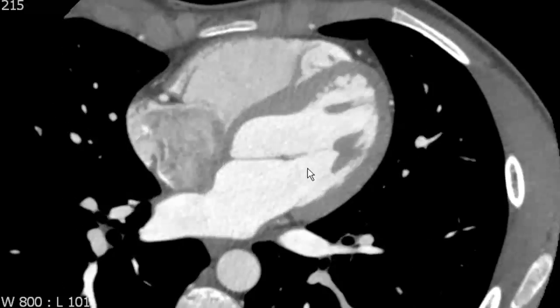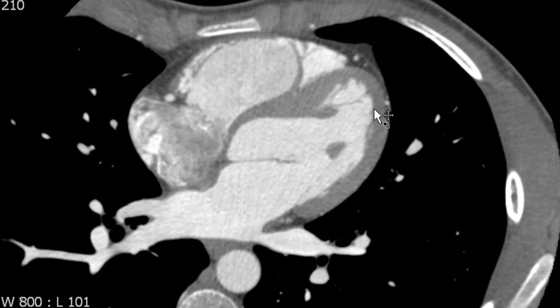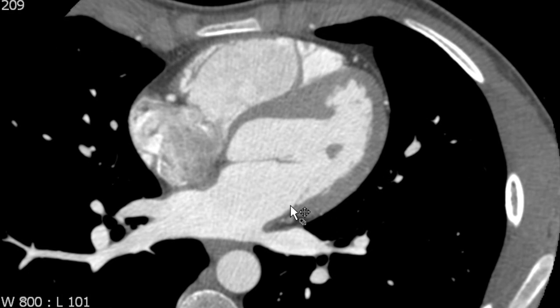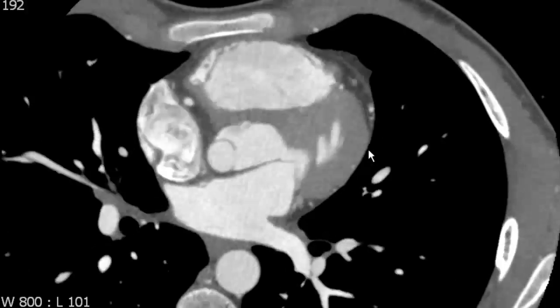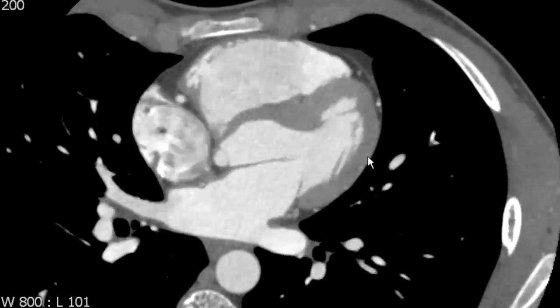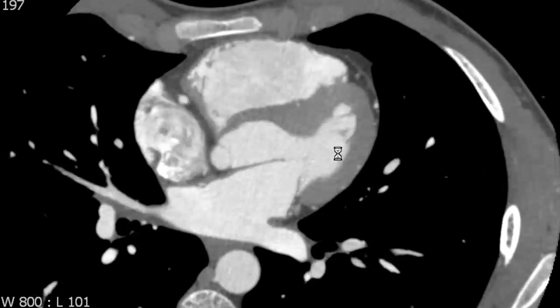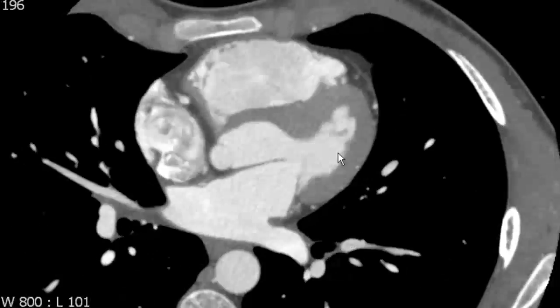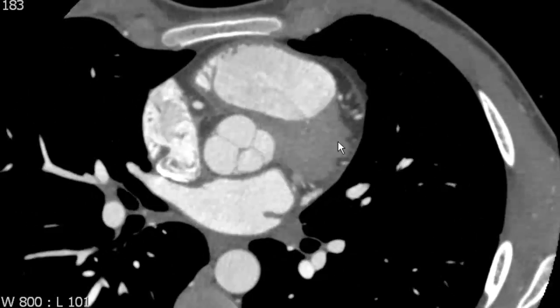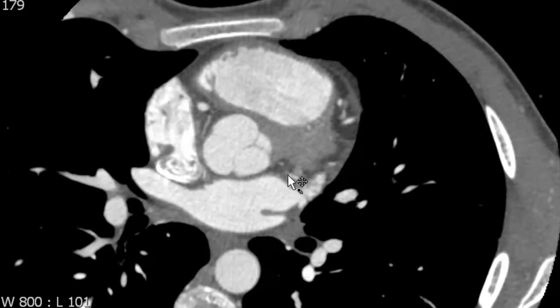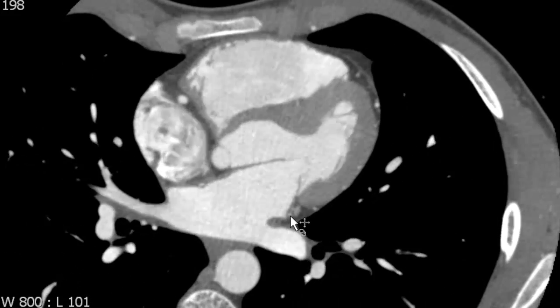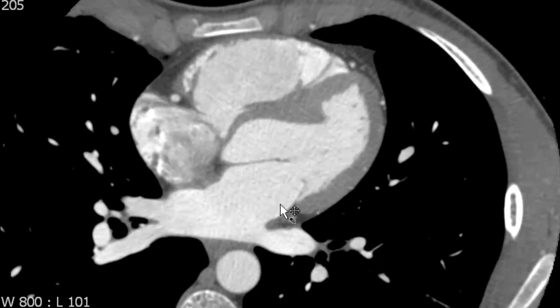As we go to the sulcus on the left margin of the heart, the left margin or the obtuse margin of the heart has another one of these little gull wing shape contours. We can see that there's a blood vessel that lives in this particular sulcus as well. This is a sulcus that separates the left ventricle from the left atrium, so we call it the atrioventricular sulcus or AV sulcus. The blood vessel that lives in this sulcus is the left circumflex artery.